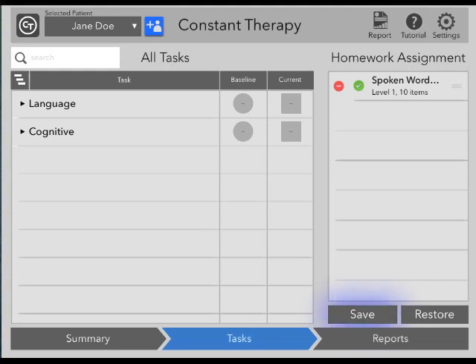The Summary tab, the Tasks tab, and the Reports tab. You can see these options at the bottom of the screen. I will now review the Tasks tab. This screen gives you access to all of the cognitive and language tasks. Here, you are able to assess and identify the tasks most appropriate for your patient, and then to also create a homework assignment.